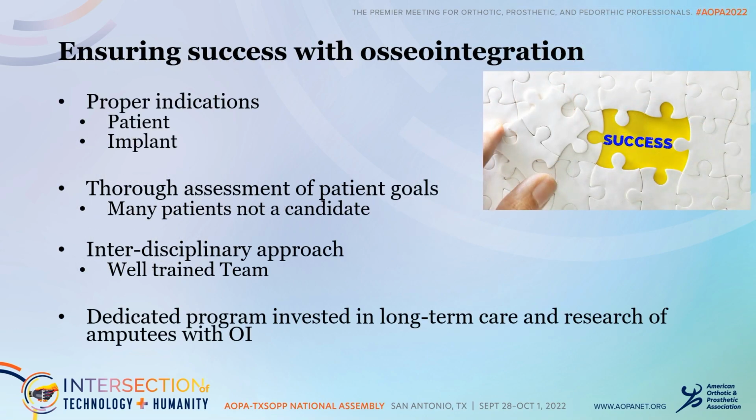So how do we ensure success with osseointegration? Osseointegration is not for every patient. I am not the surgeon that's here to tell you all that every patient should be evaluated for osseointegration. There are many patients who are evaluated by our program who I say, you are doing fantastic. You have a well-fitting socket, you don't have wound breakdown, you're an extreme athlete, you're wearing it 12 hours a day. I don't think this is in your best interest.